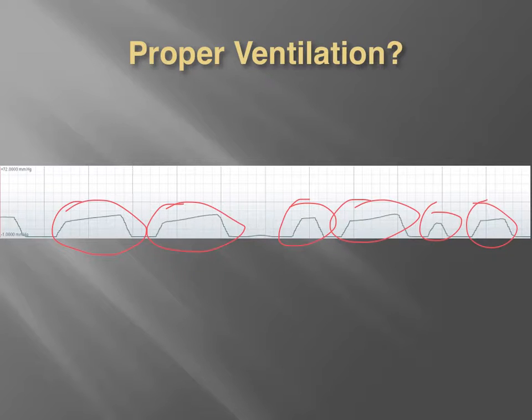Now you're going to say, well, these smaller waveforms could also be the patient maybe fighting us and he's not well sedated. That might be the case, but if I were to pull up this trend report on this, which I've done before, you can see that this ventilation rate continues like this, and there's no indications from the patient care report either that the patient needed additional sedation or anything of that nature.